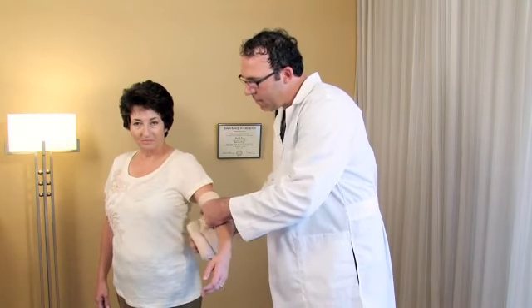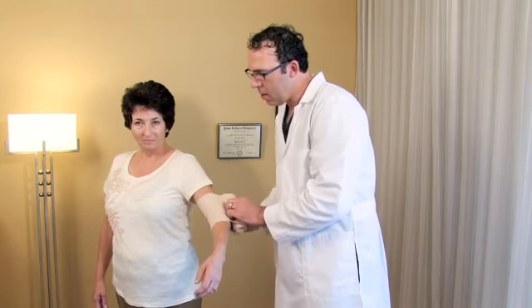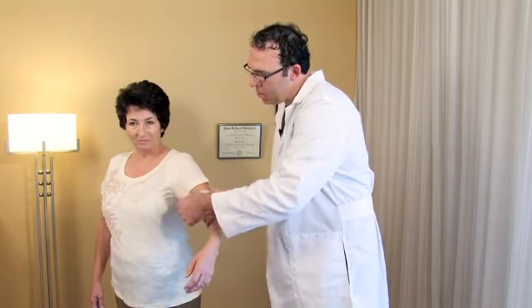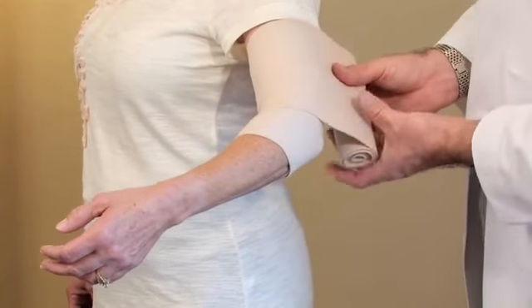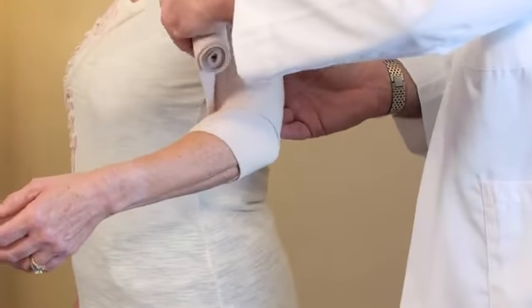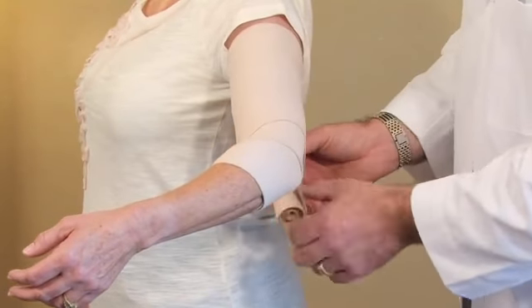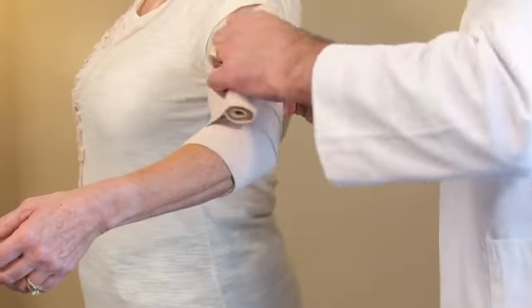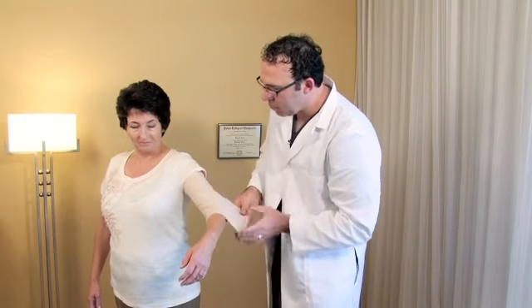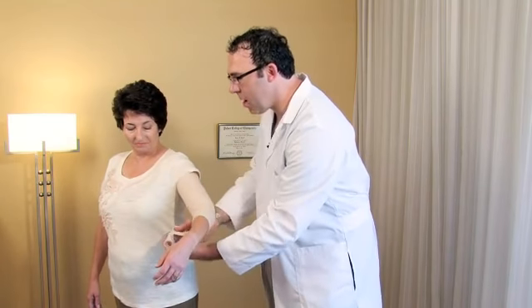Make one and a half wraps around the elbow to hold the bandage in place, then start to angle upward to the middle part of the upper arm, pulling with just a little bit of pressure. You're going to overlap about 50% of the prior wrap, then come down in a figure-8 type direction across the elbow to the middle part of the forearm.